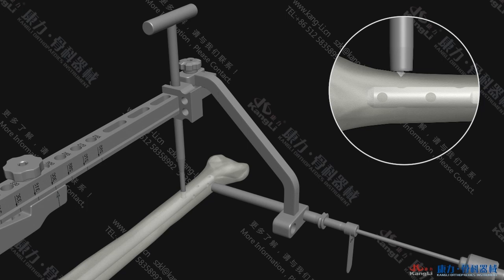When a small pit shows up on the bone cortex, drill with the 4.0 drill bit. When the first layer of bone cortex is drilled through and the 4.0 drill bit reaches the inner wall of the contralateral medullary cavity, adjust the distance between the bone spike on the 4.0 drill bit and the 4.0 inner sleeve to about 0.8 cm using an SL wrench to protect the soft tissue of the contralateral skin. Then continue drilling until the contralateral bone cortex is drilled through.